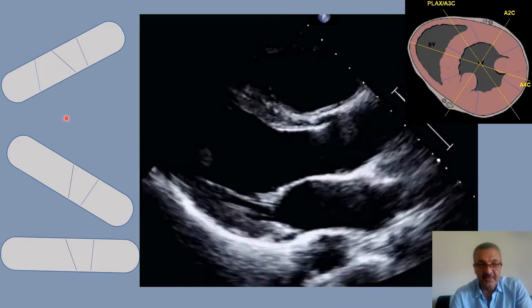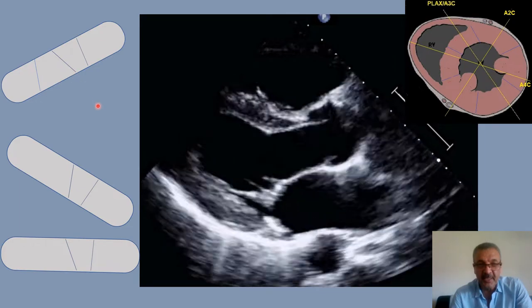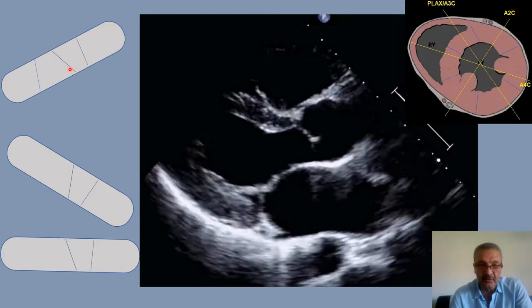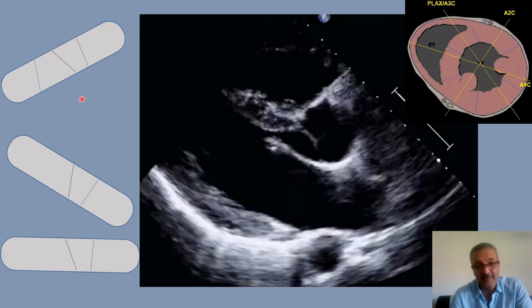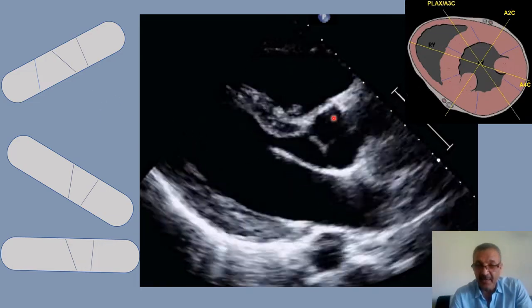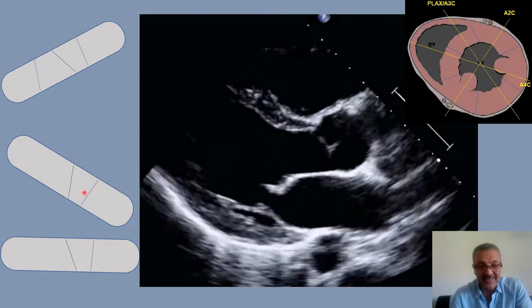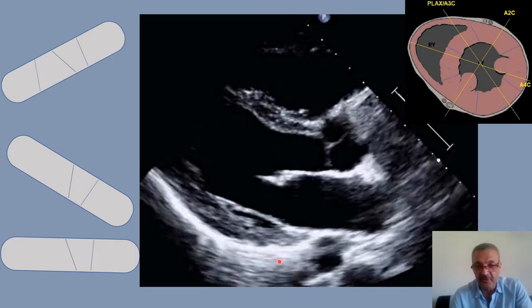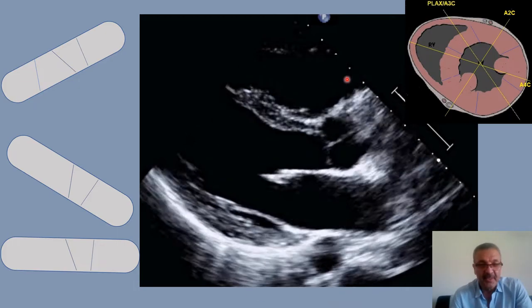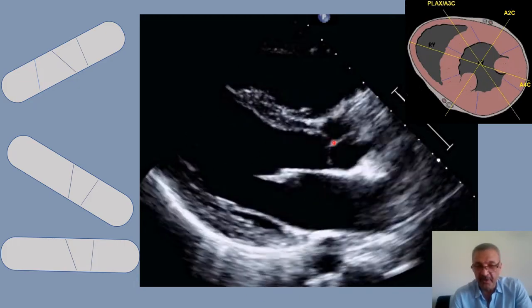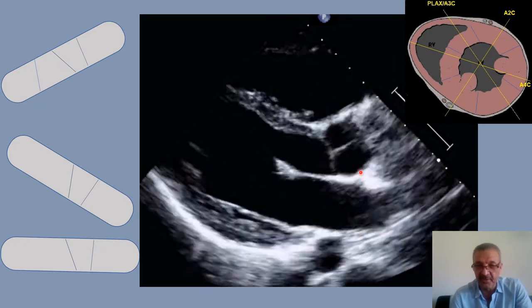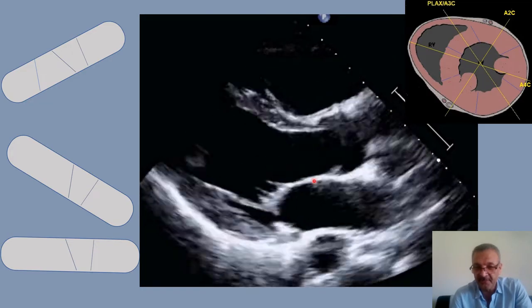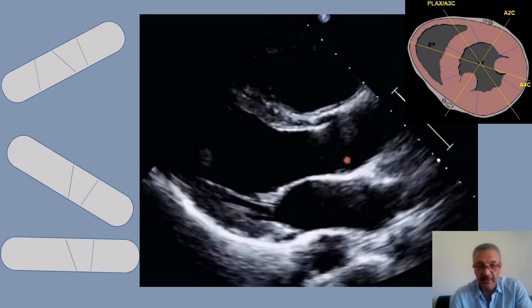The same rule applies upside down — the line for diameter measurement is the one perpendicular to both sides. Many techs, especially when measuring IVS and LVOT, make the mistake of measuring perpendicular to the monitor rather than to the structure. That is wrong. If you want to measure the LVOT or aortic root, the measurement line must be perpendicular to both sides. Not straight down or sideways — perpendicular.